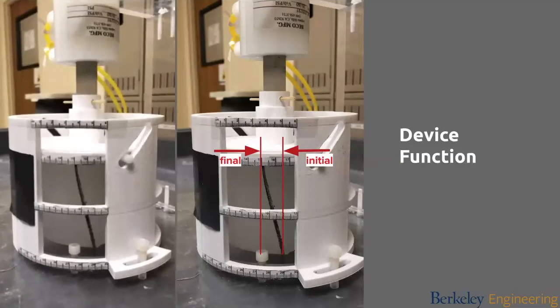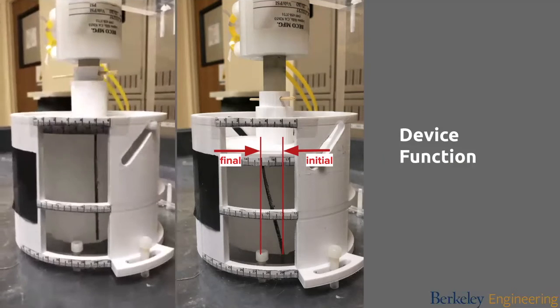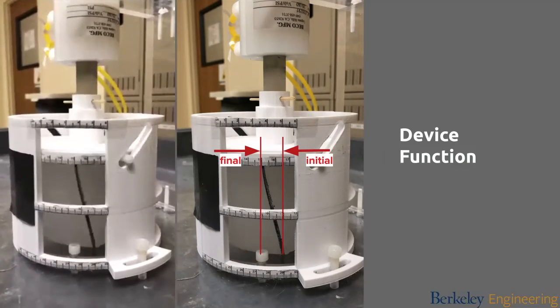Here is the device twisting and compressing the gel phantom by 1 inch. By using a visual marking on the phantom, the amount of twist was calculated to be 12.5 degrees, which is in the ideal range for a healthy heart.